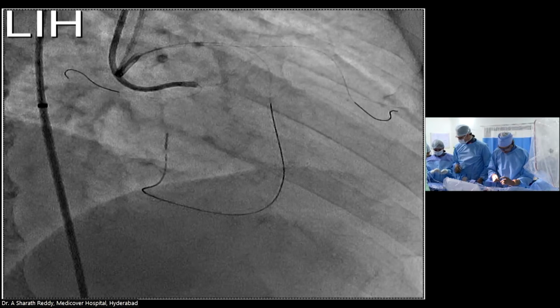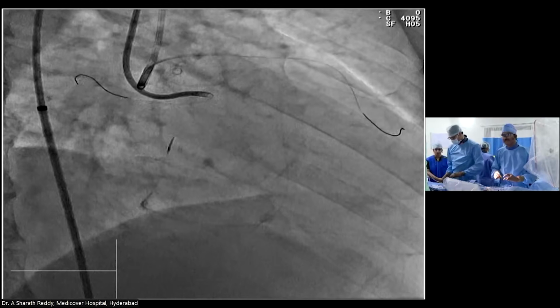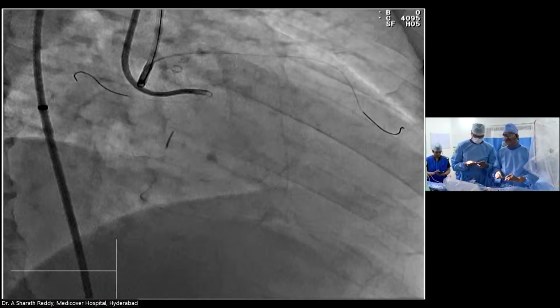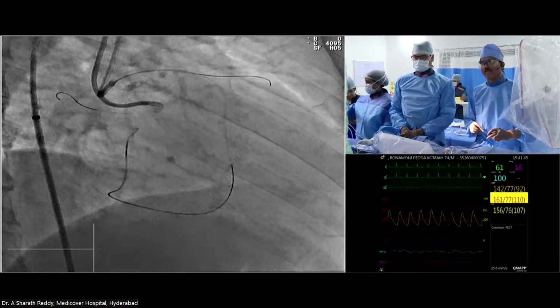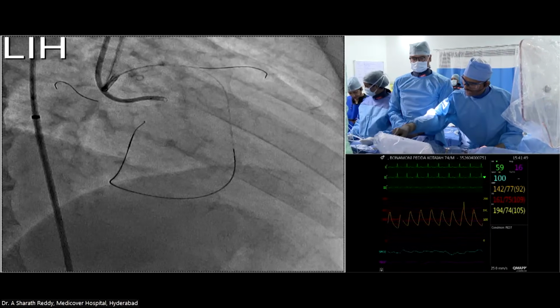So Sharath, we have your transmission on the side screen. So we can follow these steps, and now we go to the other cath lab if they are ready. Sure. Sharath, Ganesh here, we are back with you. Oh, okay. So I'll show you what we tried.